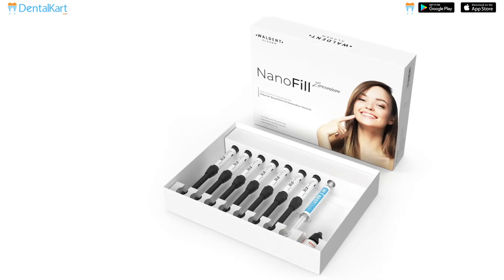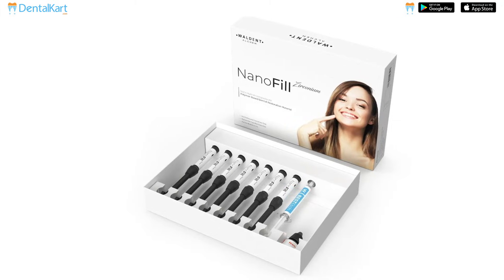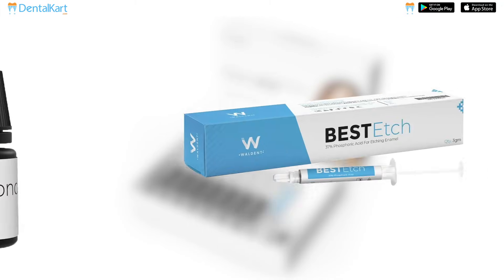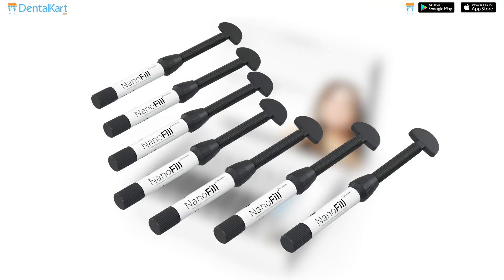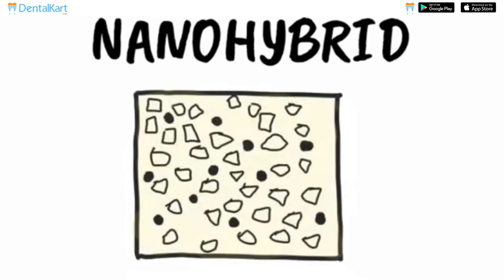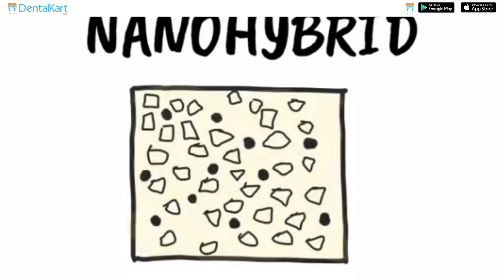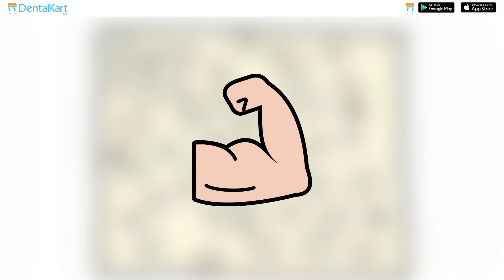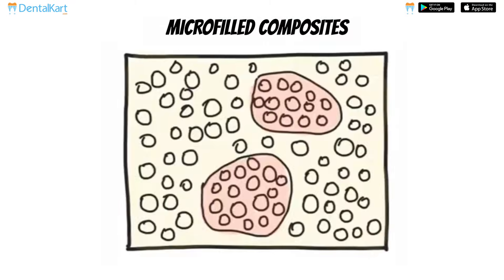This kit includes all the products required for a composite restoration such as Waldent Nanobond bonding agent, BestEtch, and Nanofill Zirconium Composite Syringes. The composite syringes are a light-cured, radiopaque, nano-hybrid composite formulated with nano-cluster filler particles that offer the strength of a hybrid and polish of a micro-fill composite.